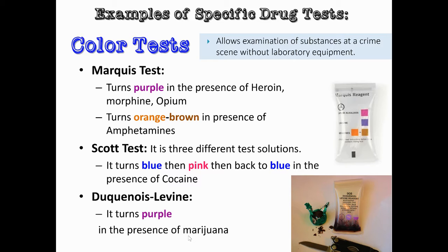And so there is a chemical reactivity test going on in there in some form. You're going to destroy your substance after you have done this test. And so a forensic scientist wouldn't use all of it because they had to keep some for evidence. But what you need to know, these are color tests. They're chemical reactivity tests of the sort, and they are presumptive. Okay, they do not confirm it's there, but it's a pretty good indication that you should do more testing with confirmatory testing.